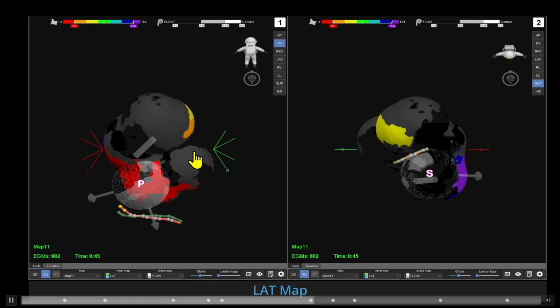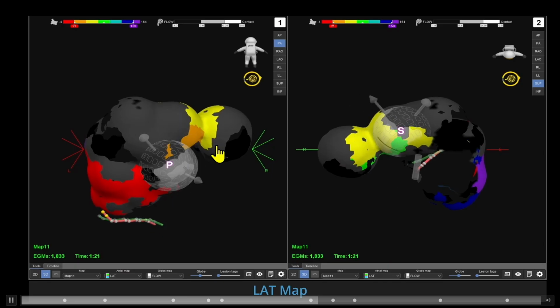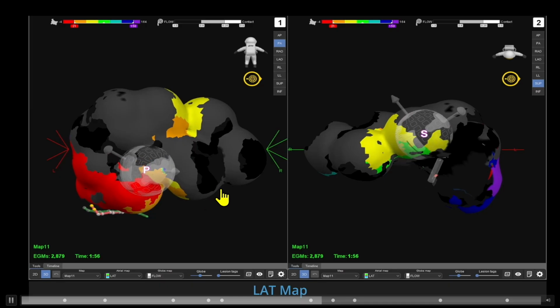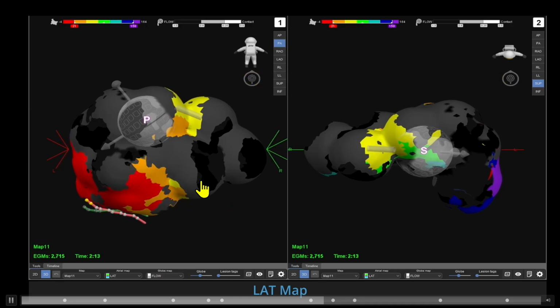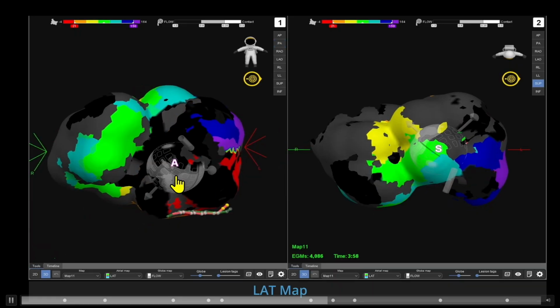Now, in this particular case, I believe, yeah, okay. And then afterwards, what we're doing here is just doing an activation map. So here it's sped up a little bit, obviously, but we're manipulating the chamber, the device within the chamber, and we'll see what it looks like at the end here.